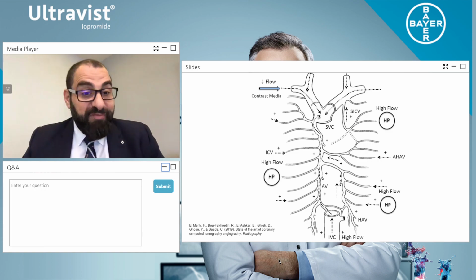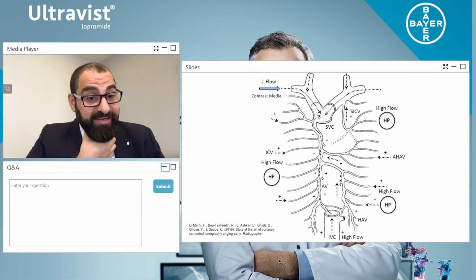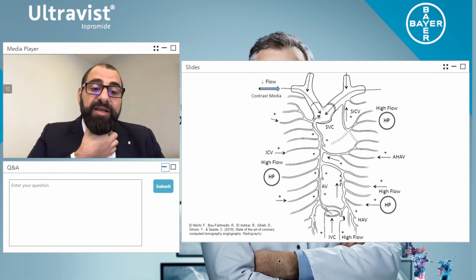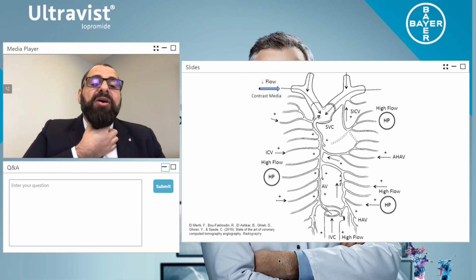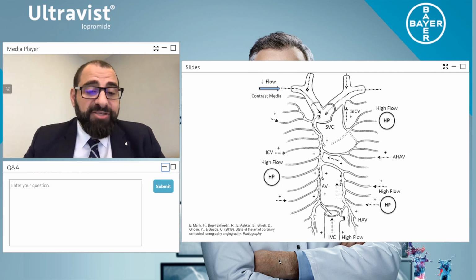Now, how do we fix this? Let's put our 2 fingers again on the carotid pulse. We're going to do what we did last time. Now, I want you to do it with your mouth open, as if you're going to the dentist, okay? So we all ready? Okay. Now, breathe in and hold your breath. Keep your mouth open. Breathe away.